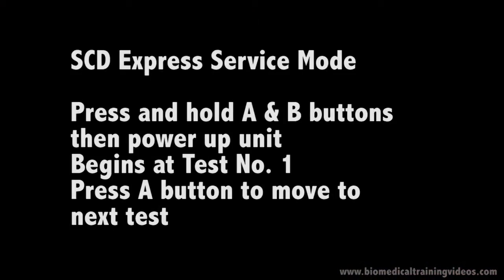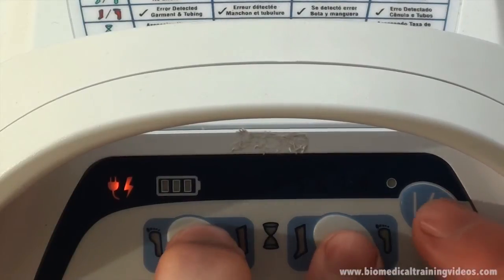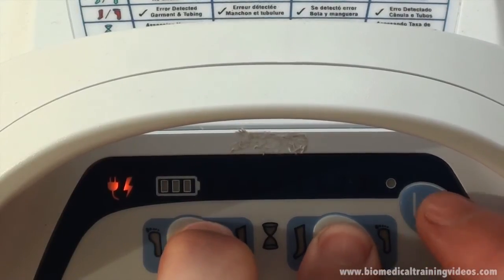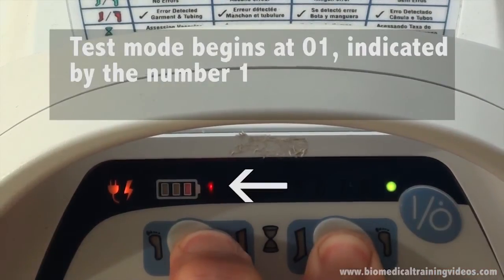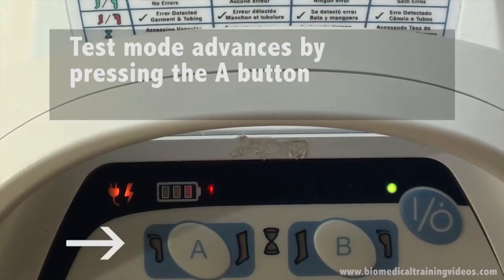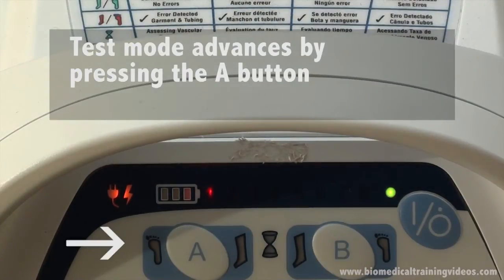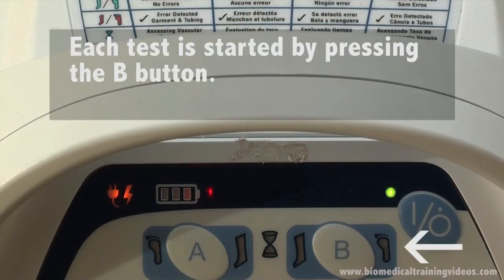Now we go through the service mode. This is activated by holding the A and B buttons down when powering up the unit, and we begin at test number 1. We advance through the tests by pressing the A button, and we start each test by pressing the B button.